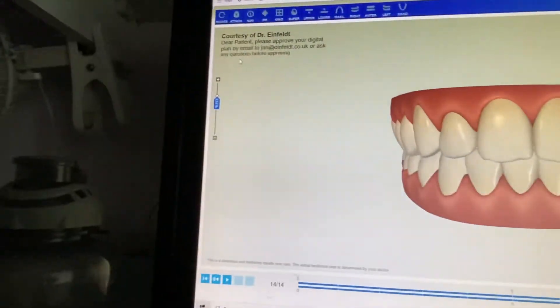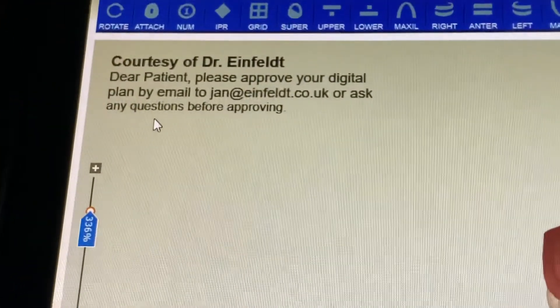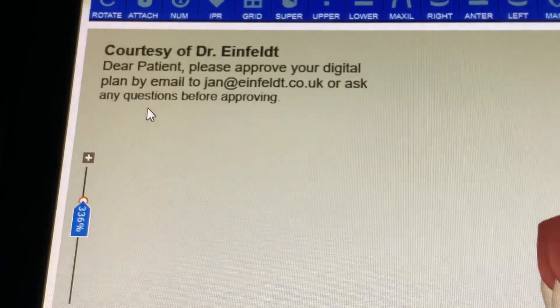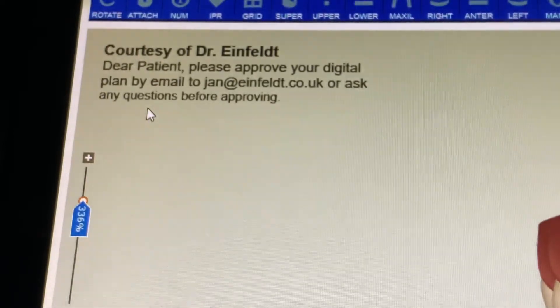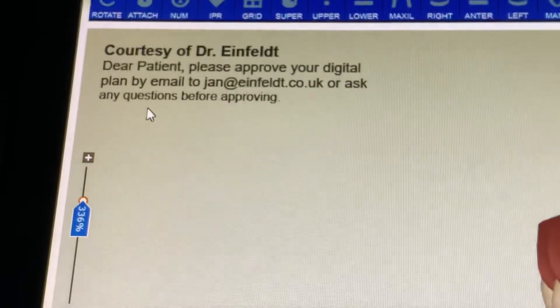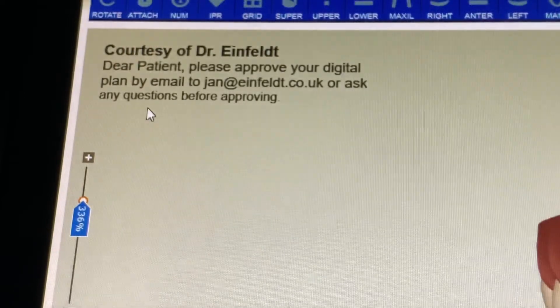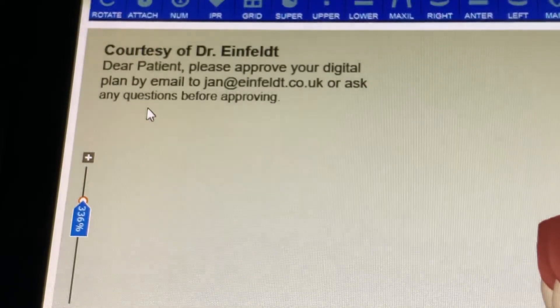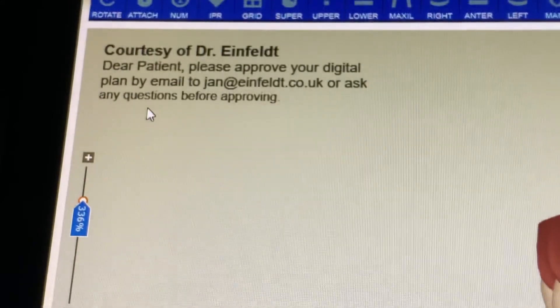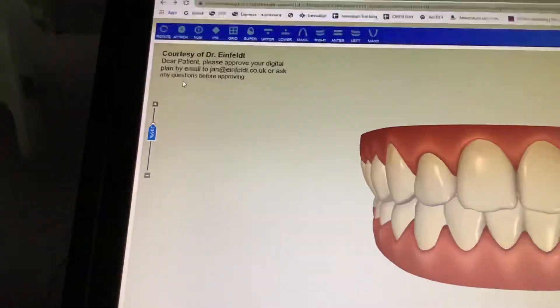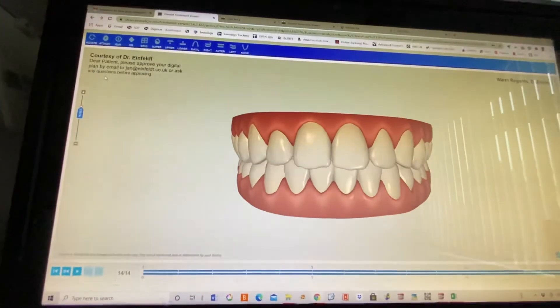In the top left corner you see a message — it says courtesy of Dr. Einfeld: 'Dear patient, please approve your digital plan by email to jan.einfeld.co.uk or ask any questions before approving.' So you just need to send an email to this address saying 'I approve my plan.' If you've got any questions, please ask them before approving, because we might have a meeting in the practice or via Zoom to answer any outstanding questions. Once you approve the plan and the aligners get manufactured, we can't easily change them, at least not without cost implications. So this is your chance to see and approve the plan.